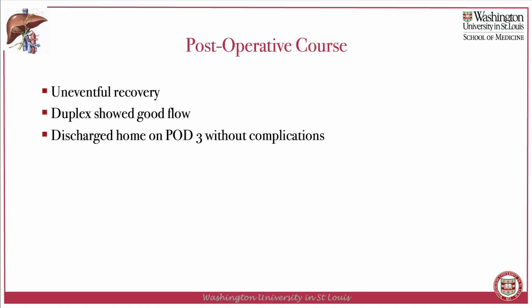The patient did well, had an uneventful recovery. Duplex showed good flow postoperatively, and she went home on day 3 without any complications. Thank you.